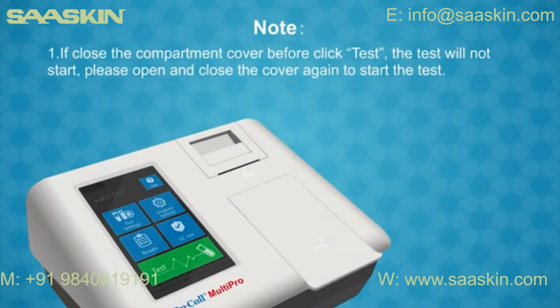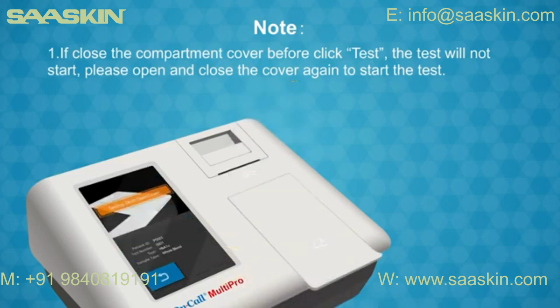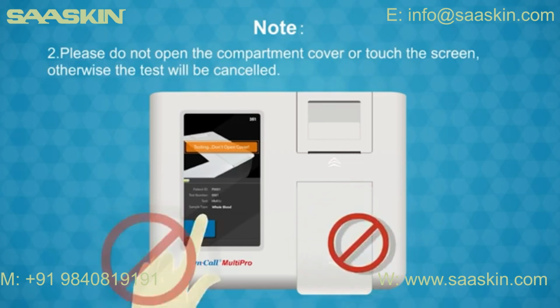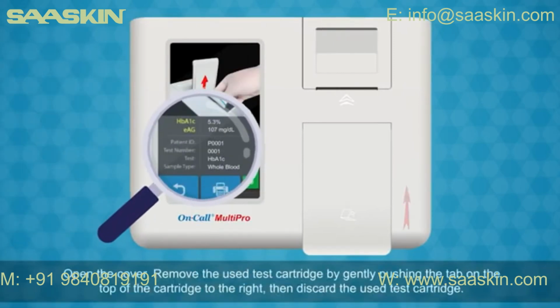Note: 1. If you close the compartment cover before clicking Test, the test will not start. Please open and close the cover again to start the test. 2. Please do not open the compartment cover or touch the screen, otherwise the test will be cancelled. After the test is completed, the results will be displayed on the screen.